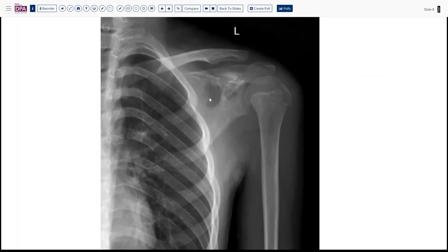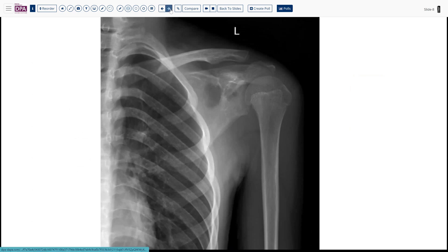The scapular lesion is lytic and somewhat expansile, with variable mineralization around the area. The margins look fairly sharp, but there is some heterogeneity suggesting a degree of infiltration — another example of how the lesion can appear in a flat bone.